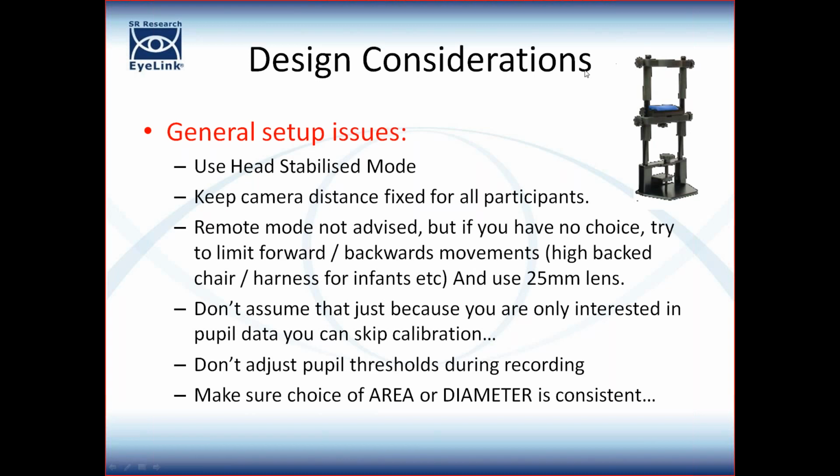the headrest. This also has the advantage that it makes sure that people's eyes are always aligned with the top quarter of the screen, which is what they should be according to our optimal setup guide. So if you keep the forehead bit there and put a face in here, the eyes are going to be the same distance from the camera, assuming that you don't move your camera, for each participant. As we will see, this is important for when it comes to converting pupil size to millimeters.